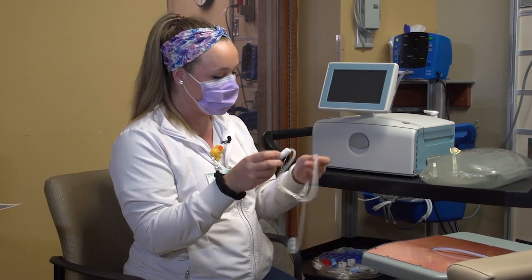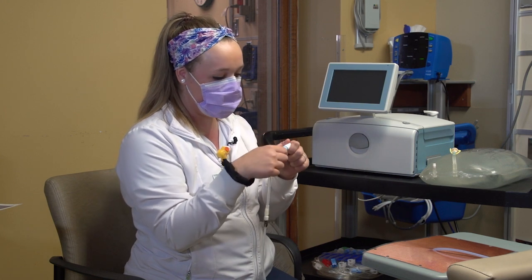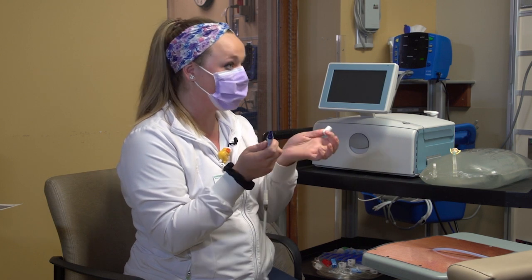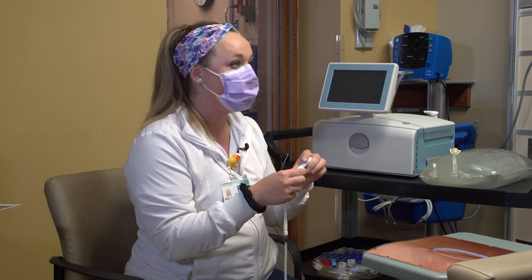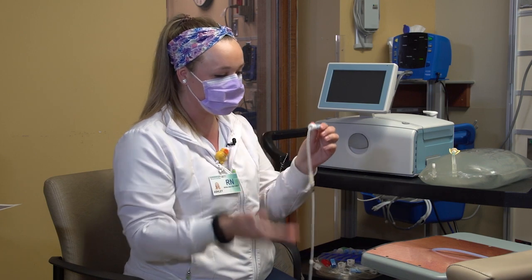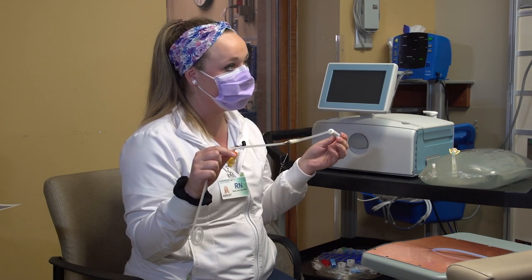It's easy to bend, move around. This is where we would hook up for our treatments. It's got a cap. This is sterile typically, and we'll go over that more in education. And then this is the clamp that we use. So that is unclamped and allows fluid to move freely, and this is clamped, and that will not let any fluid in or out of your peritoneal cavity.